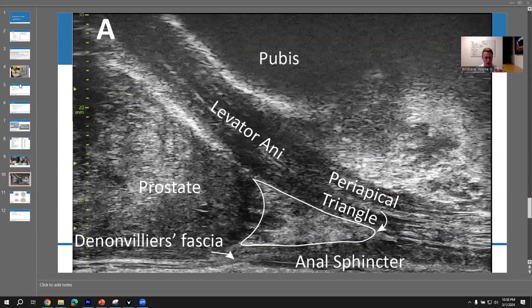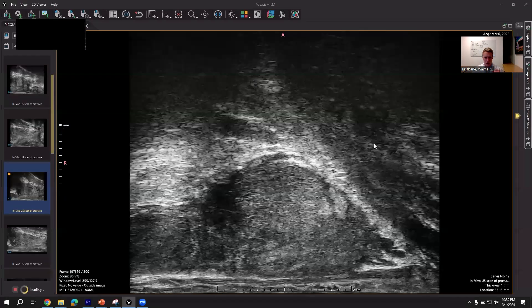So that first needle comes in and it gets the tissue on this side of the screen, kind of before Colles' fascia. Then you're going to use that six inch needle and insert it into the periapical triangle, which is a great place for the anesthesia. A couple of tips and tricks on that: you really don't want that needle to come in and hit this muscle first — that kind of sends an electrical jolt down the patient's phallus and they don't love it. They'll do one of those kind of kicks and it's really uncomfortable. So what you really want to do is come medial to the levator ani muscles, right underneath the urethra. To show you that, I'm going to bring in a micro ultrasound.